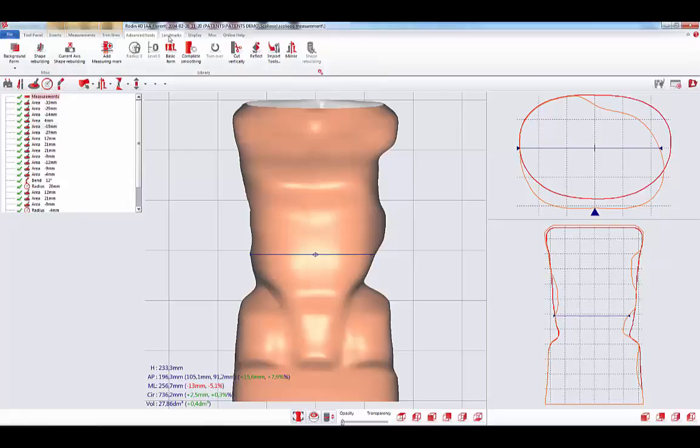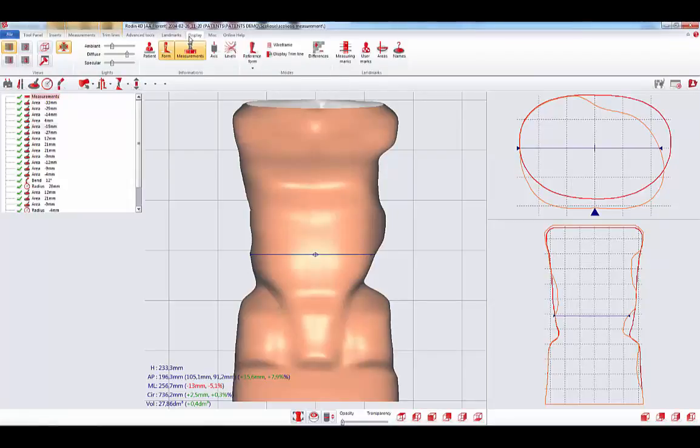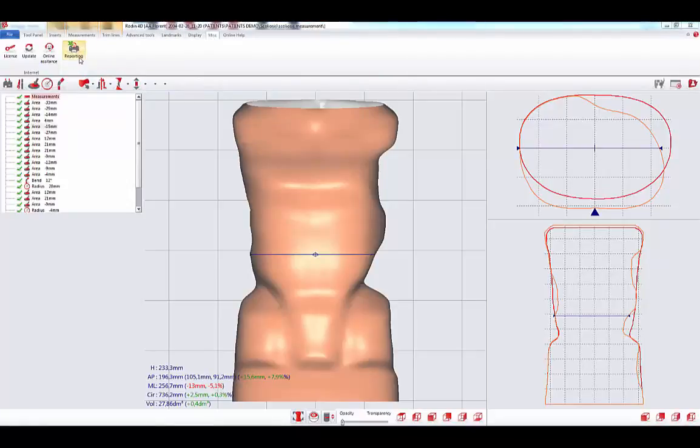Then you have the Landmarks tab, the Display tab, the Misc tab with the Reporting function which is new in Rodin 4D Neo.